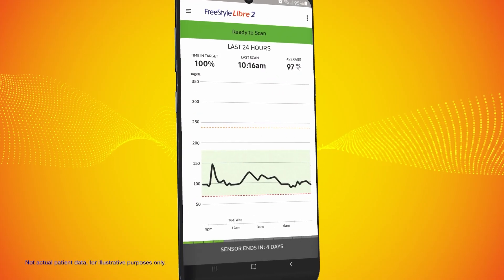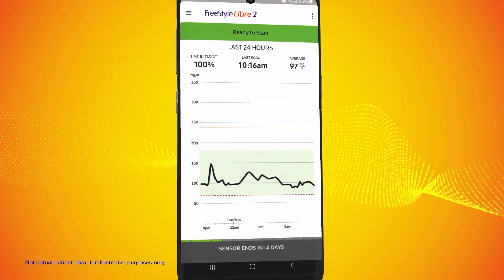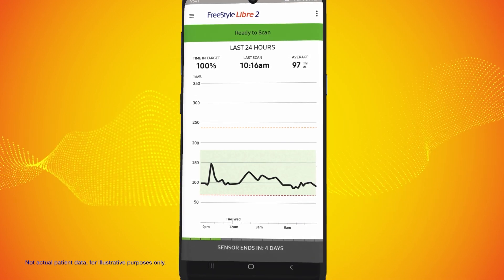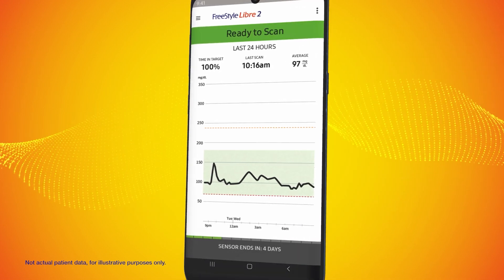If you're using an Android phone, you do not need to tap any scan buttons. The app is automatically in a scan-ready state when you open it.